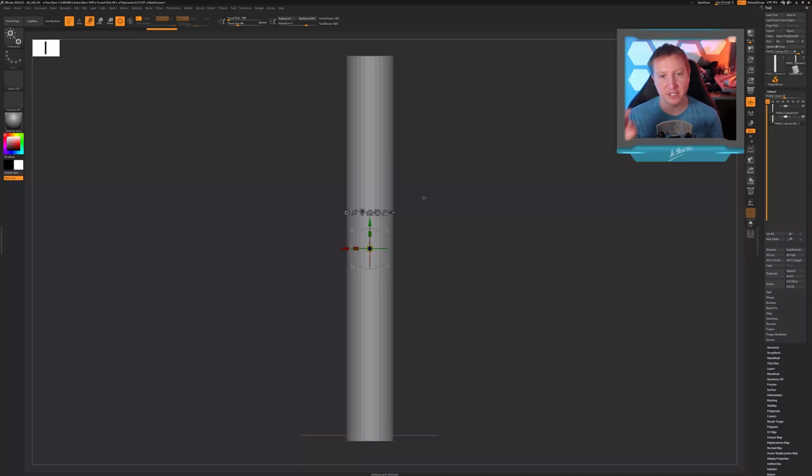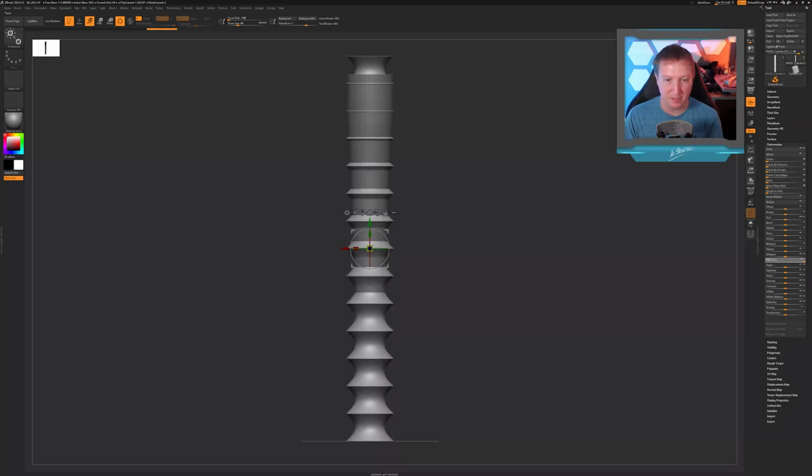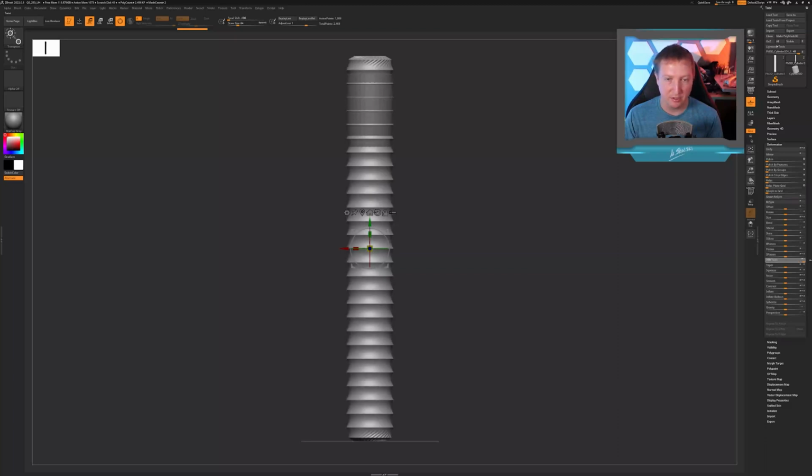And now we need to turn this into threads. The first thing I need to do is remesh this, because if I were to turn this into threads right away, if I come down here to my deformation menu and twist these in the Y plane, it's not going to give me enough threads. So I need to create more vertical divisions here. Let's just see what happens if I divide this geometry once, and let's see how many threads that gives us. So let me come back here to deformation. Let's twist this. All right, that looks like about the right number of threads.